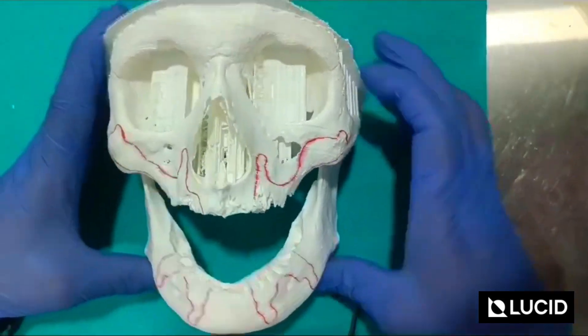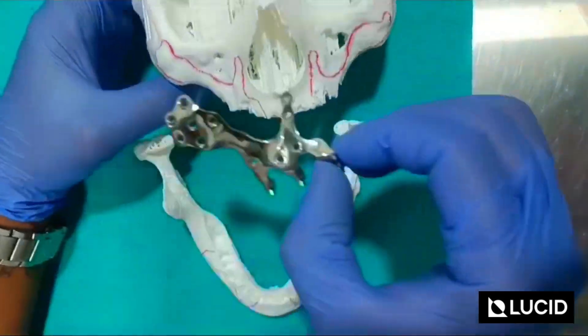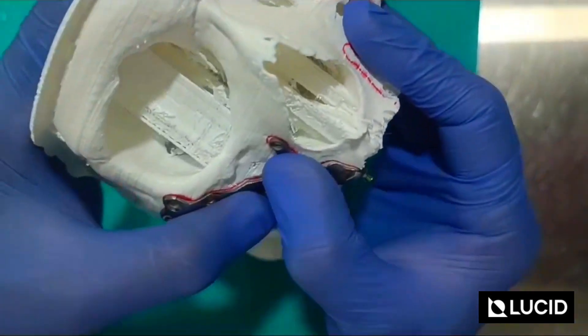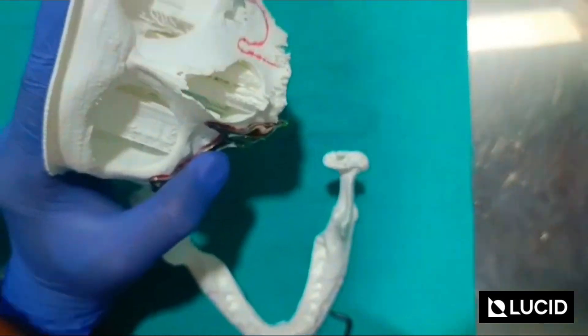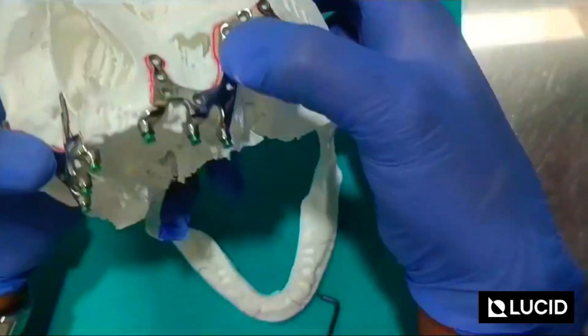As far as the maxilla implant is concerned, this is the right side maxilla implant. In this location only, I am going to place it like this — and you can see how it gets placed. The second implant: again, you have to place it in this location.